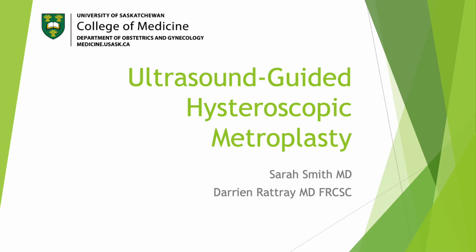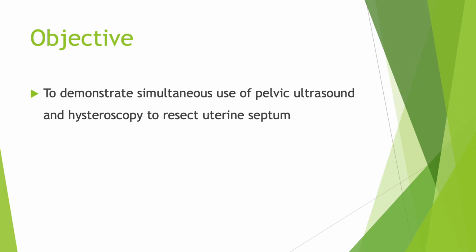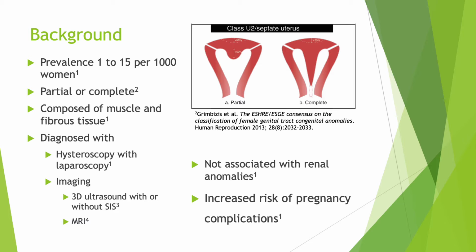We present to you a case of ultrasound-guided hysteroscopic metroplasty. This video will demonstrate simultaneous use of pelvic ultrasound and hysteroscopy to resect uterine septum. Septate uteri are found in 1 to 15 per 1,000 women.